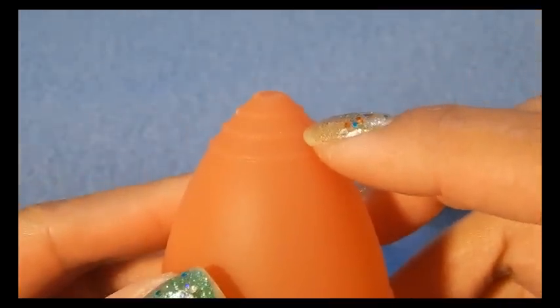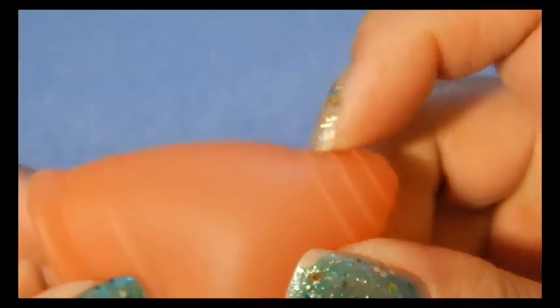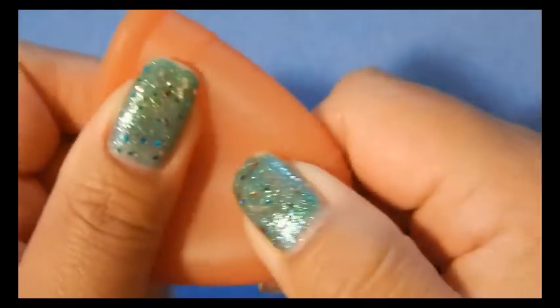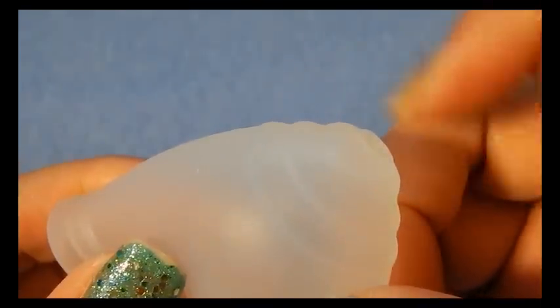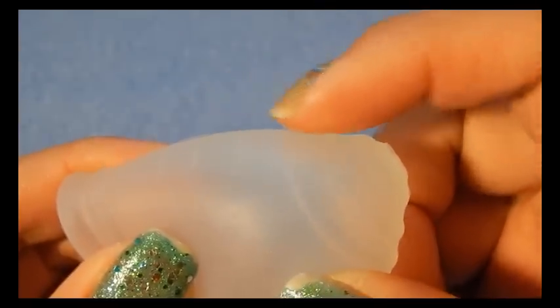The grip rings on the Lunette — there are three — and they are raised quite a bit. They do have an edge; there's not a smooth transition on them, but it gives a really good gripping area to remove your cup. The Ruby cup also has three grip rings. They are raised but they have a smooth transition between them all, which is a nice design for people who might be sensitive to those things.